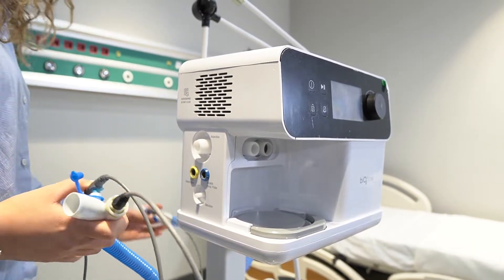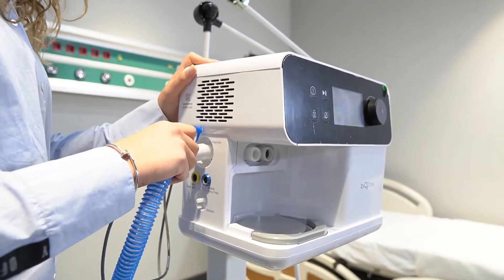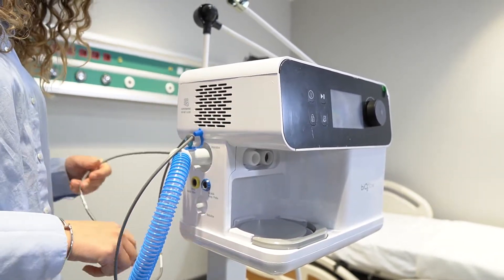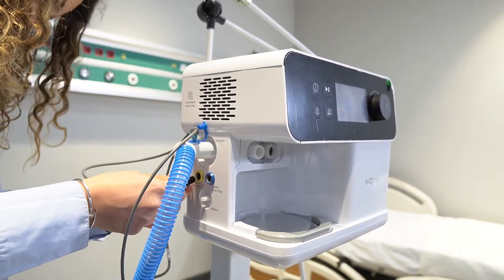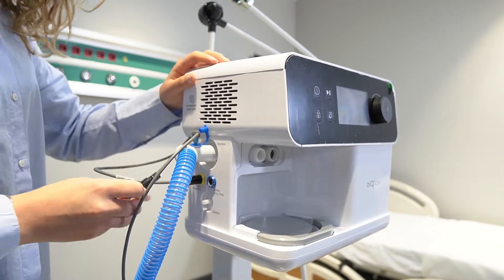Afterwards, the patient circuit is inserted to the device. The probe and adapter are inserted to the device as designated, paying attention to their latches.